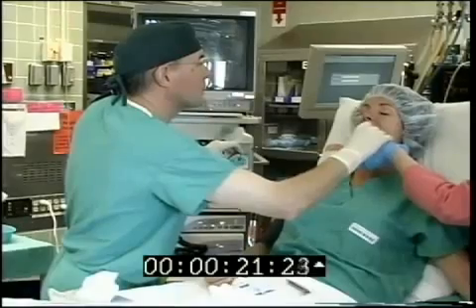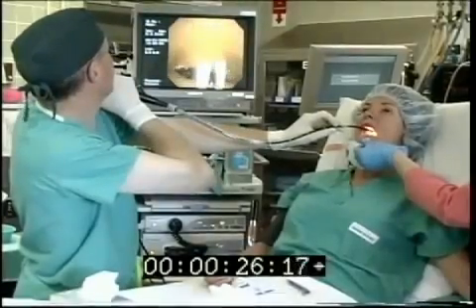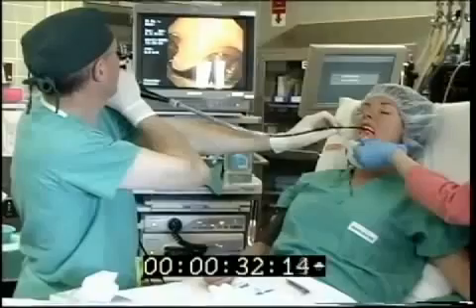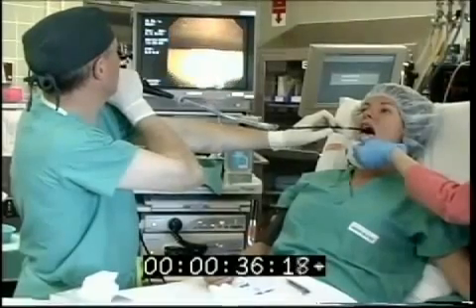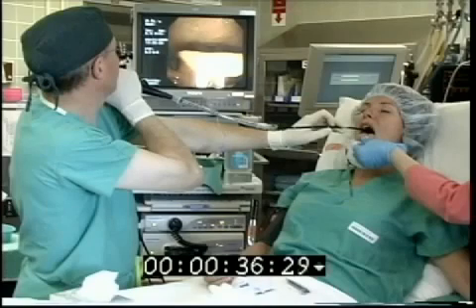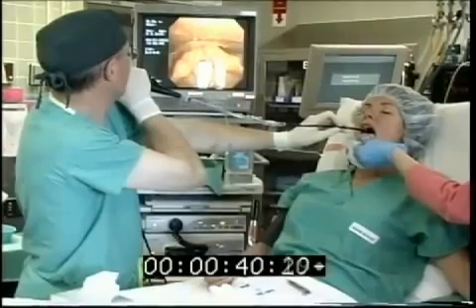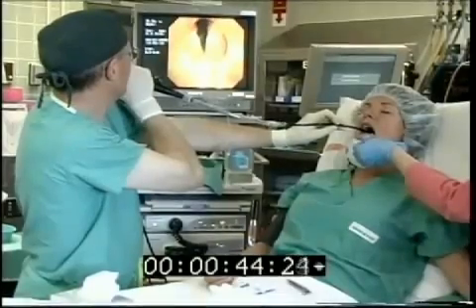To elevate the epiglottis, gentle tongue traction with a gauze is provided by an assistant. The scope is inserted into the oral cavity in the midline and then advanced slowly over the tongue towards the uvula. Gently resting the hand holding the shaft of the scope on the patient's chin may help keep the scope in the midline. The scope is advanced past the uvula and flexed caudally to visualize the epiglottis. If the epiglottis is oriented posteriorly or is in contact with the posterior pharyngeal wall, the patient can be instructed to take a deep breath and thereby move the epiglottis anteriorly. The scope is then passed posterior to the epiglottis to visualize the vocal cords. If the bronchoscope is off midline at the level of the epiglottis, the approach to the larynx can be much more difficult.